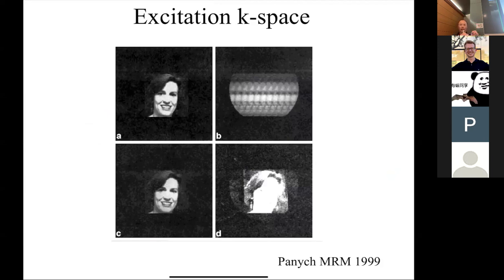Okay. He digitized it, took the Fourier transform of that, and used that Fourier transform to program the RF pulses. And essentially, this is the MR image of his wife. What he did was he programmed it so that the spins all lined up to impose the image of his wife in the spins, and then he imaged it. Okay, so that's either really cool or freaky, but it just shows you what you can do.